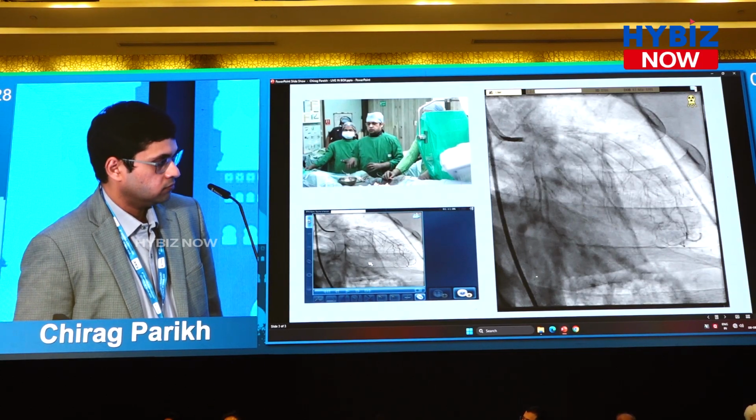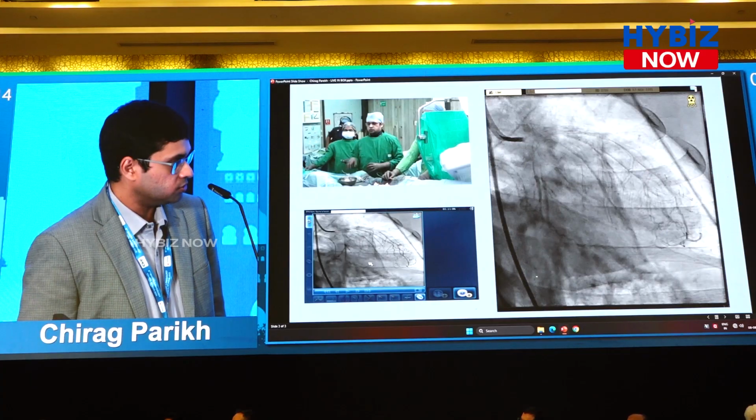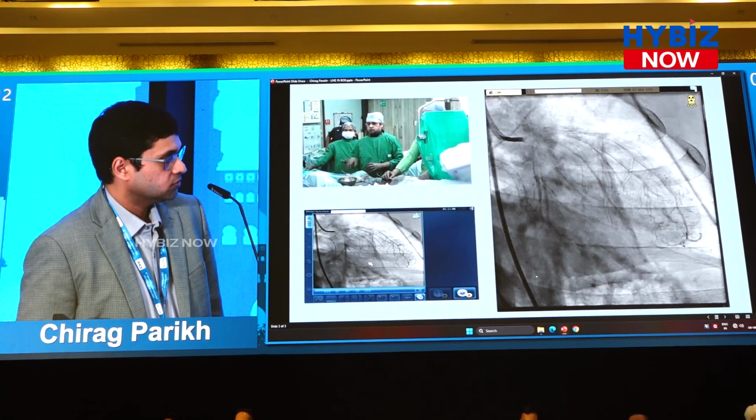I was curious to see what is actually happening at the diagonal. Was there any lipid-rich plaque? Because you have imaging on the table. We debated that, but we had already done iFR and it was a long procedure. So there are 2 points in my.